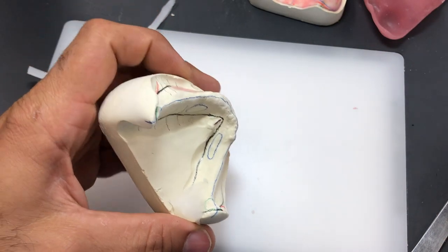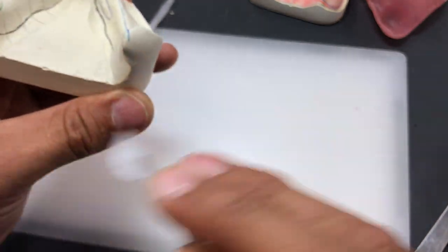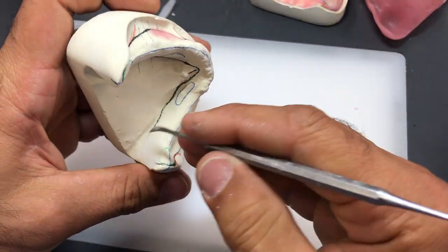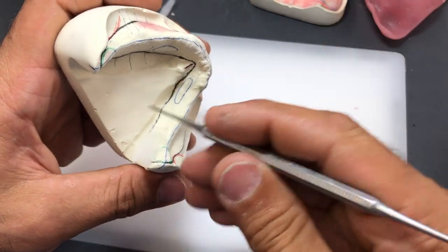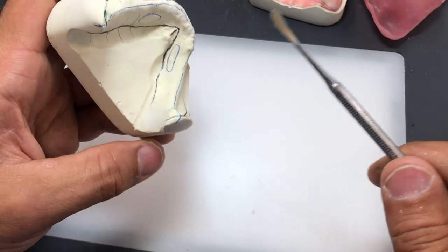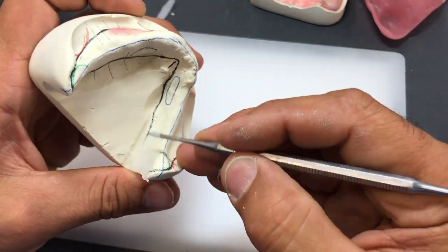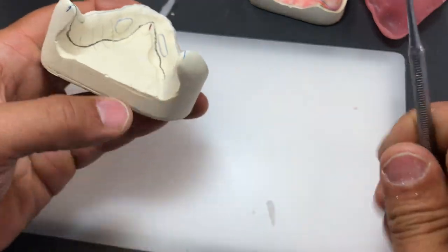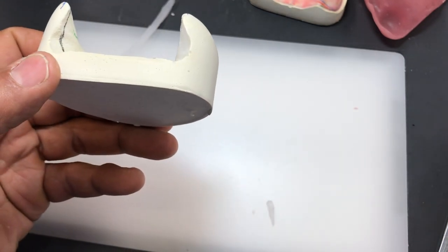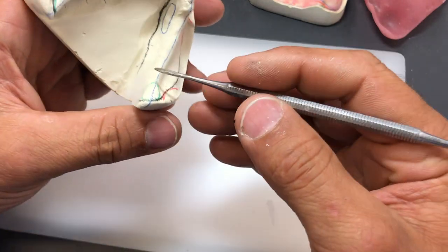I'm going to heat up my instrument, again using the tip of my number 7 spatula, and carve it as previously. And I'll burnish the wax in a little bit with the back of the number 7. So that happened very quickly. So I'll show you the before and after. So we went from that to that in about 30 seconds. But more important, it was effective.